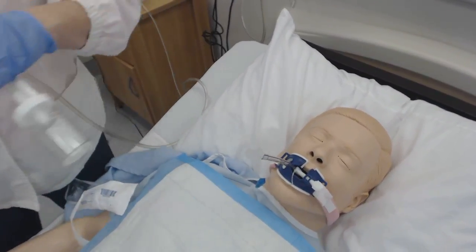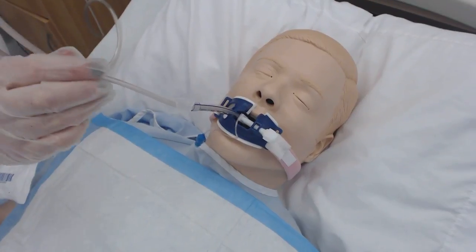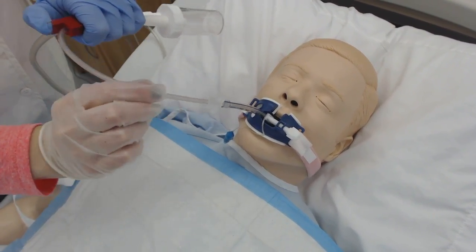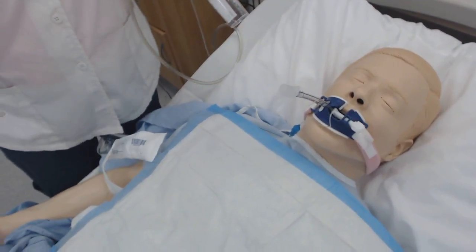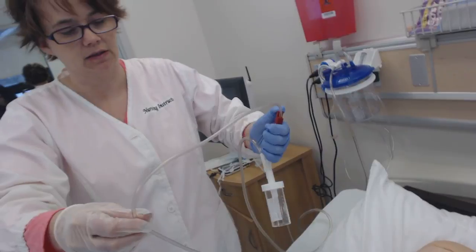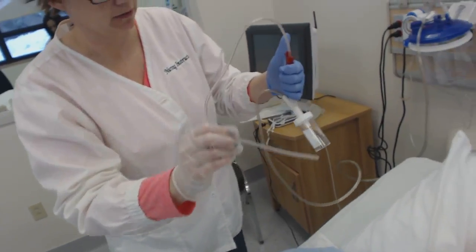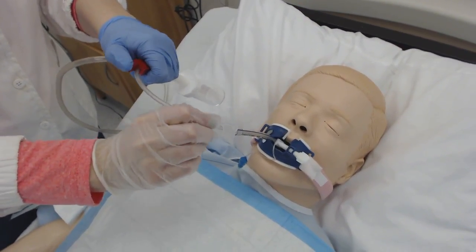I'm going to get this a little bit wet with sterile saline, place it down — going much further again because I have to go past that oral pharynx. Once the patient begins to cough, any secretions will go right into that trap. What if all the mucus stays in the tubing and doesn't go in the trap? Simple solution: give it a little sterile saline and it'll flush right in there. You want as much as you can get — if you get 20 milliliters, that's going to be plenty.